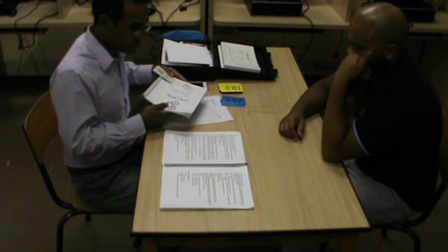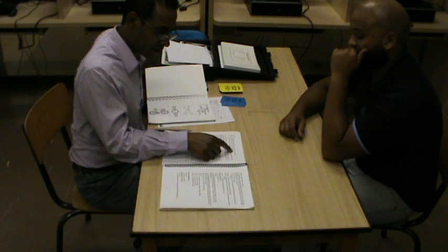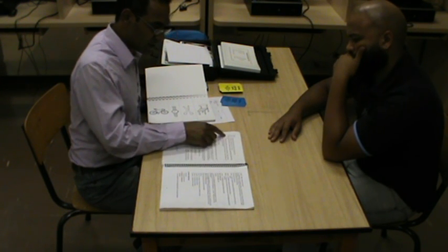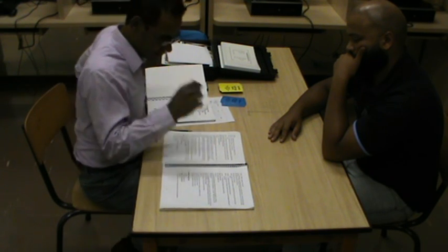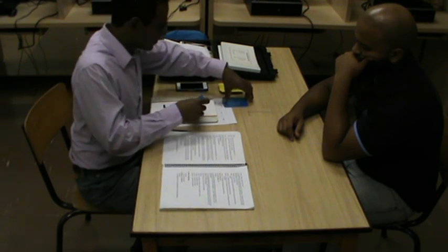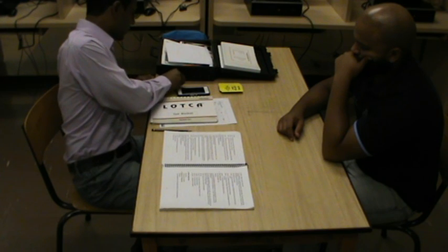Okay. For this part, in terms of scoring, it says 1 point is given if the client identifies only a few objects by exact matching. A few is interpreted as less than 4. A client is given 4 points if the client identifies all the objects by naming, understanding, etc. As I said, the interpretation of the scoring is in the manual, so you can follow it as is. The next section, what I usually like doing is once I've completed the use of a specific set of cards, I will put it away.